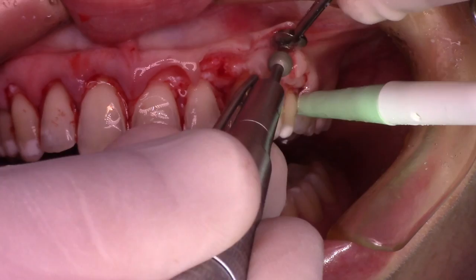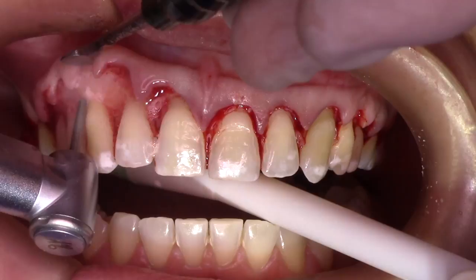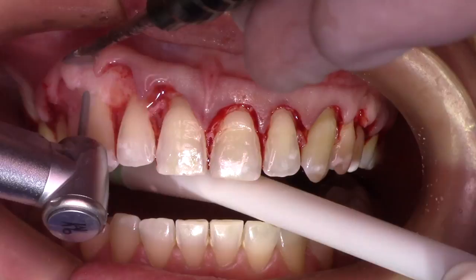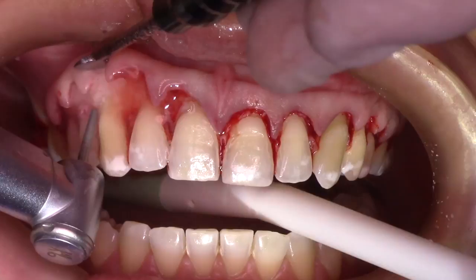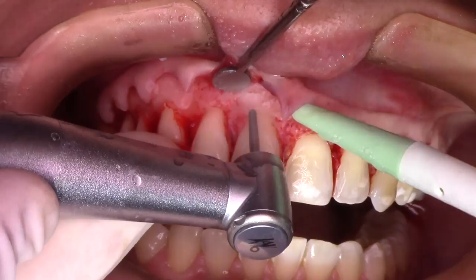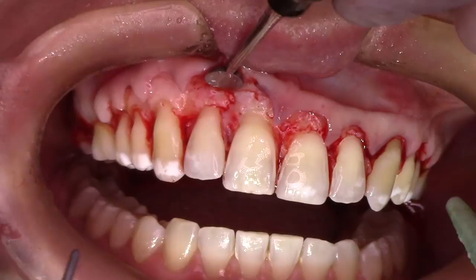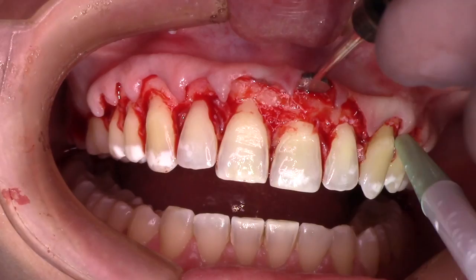When you start the bone contouring, divide it in two steps. The first step, go with a large round diamond bur in a handpiece and just wear down the exostose and let the bone get thinner close to the root. Do not touch the root, because if you leave this very thin piece of bone around the roots, it makes it easier for the second stage with chisels or a high-speed bur to take it out without working too much time close to the root, which is a very sensitive area. Always check how much bone you are taking out to establish the new biological width for the patient.